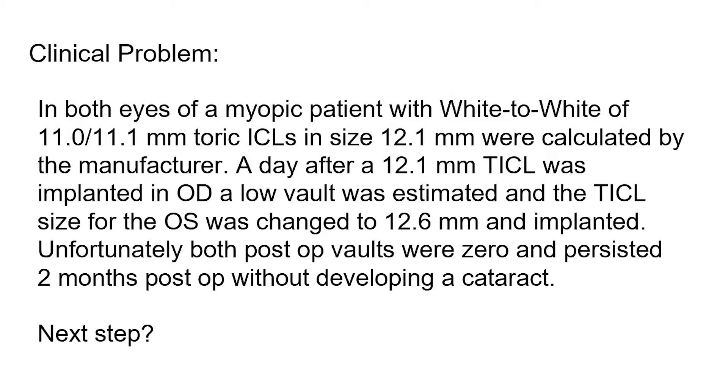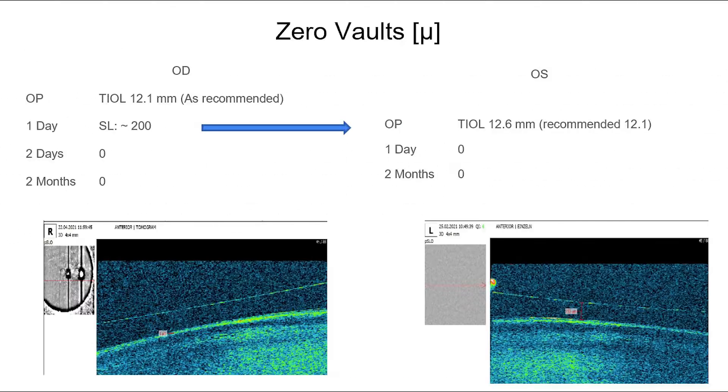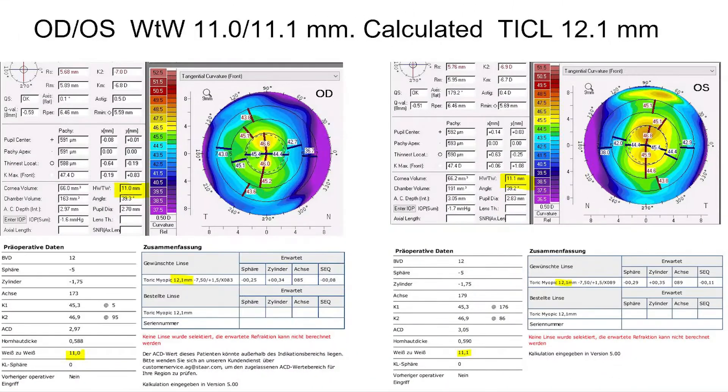This case is an implantation of toric ICLs with white-to-white of 11 mm. On the right eye, a 12.1 mm lens was implanted. The vault was a bit too low, so on the other eye, one step higher lens size was implanted. Unfortunately, both eyes had a zero vault afterwards, as you can see here on the OCTs.